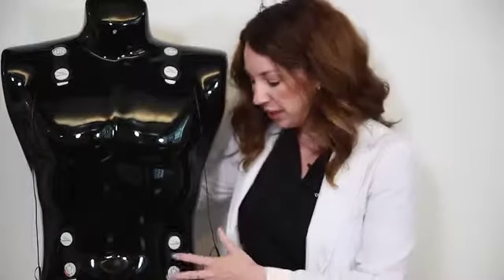Let's also talk a little bit about abdominal breathing. When your patient is particularly tachypneic and breathing really fast, you can just place all 4 sensors on the back if that's causing a lot of artifact in your patient. Feel free to go ahead and do that. We do that a lot sometimes in the emergency department.